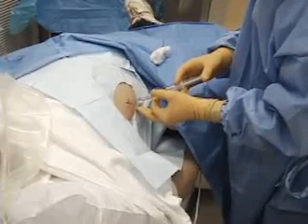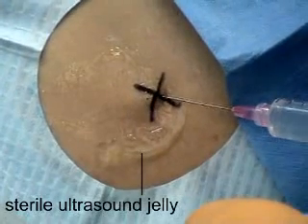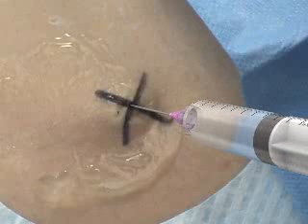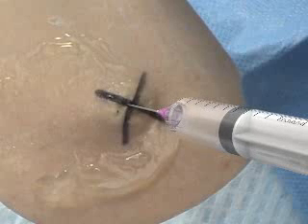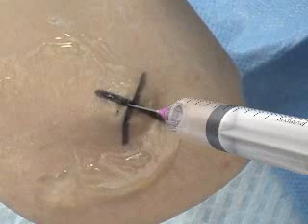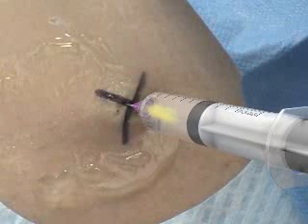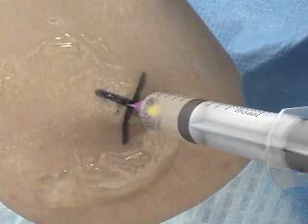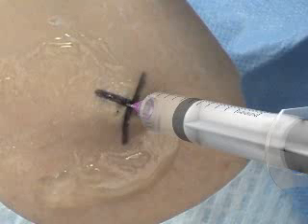Using a 22 or 25 gauge needle, anesthetize the superficial skin with a wheel of local anesthetic such as lidocaine. Continue to anesthetize the deeper tissues in the anticipated tract of the paracentesis catheter, intermittently pulling back on the syringe every 2 to 3 millimeters. Once peritoneal fluid begins to fill the syringe, inject additional anesthetic to anesthetize the highly sensitive parietal peritoneum. A total of 5 to 10 milliliters of lidocaine is generally used.